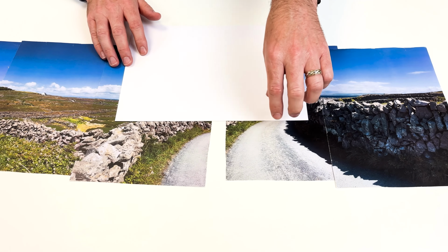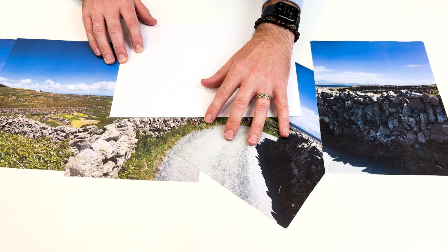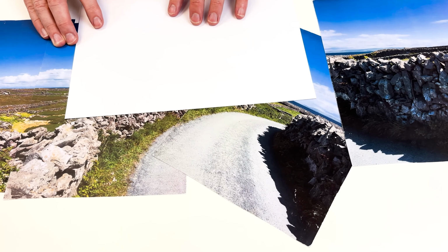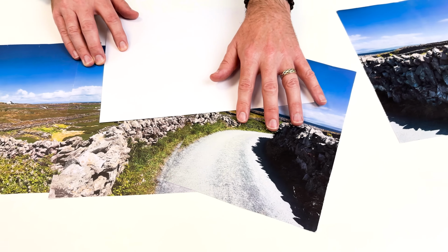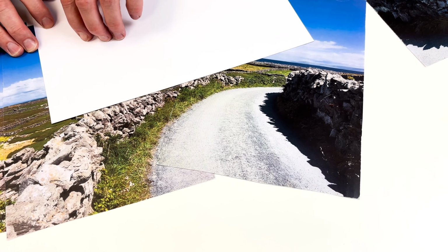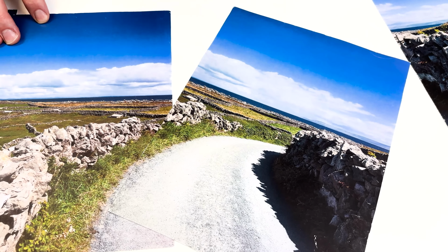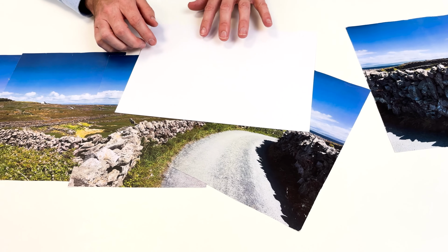And we're now bringing in an additional picture. And we could line the picture up like so. If that's all we saw, we might just line it up like that. Or maybe we do see some of the wall, and that's okay. Well, then we can maybe line things up like so. The stones seem to line up there. The grass verge seems to line up there. But what we're noticing then is as we expose the whole area, everything is wrong here. But maybe the scanner hasn't seen that because we've drifted off course. We've drifted off the path. That's all we see.